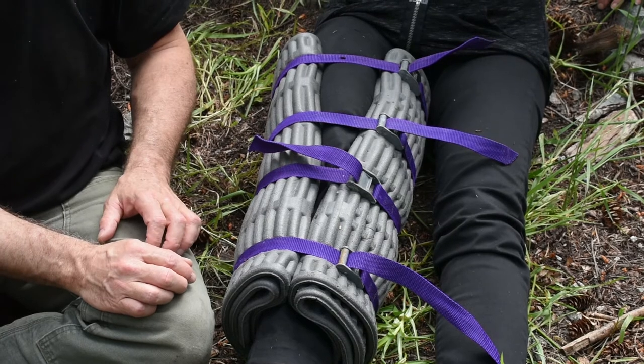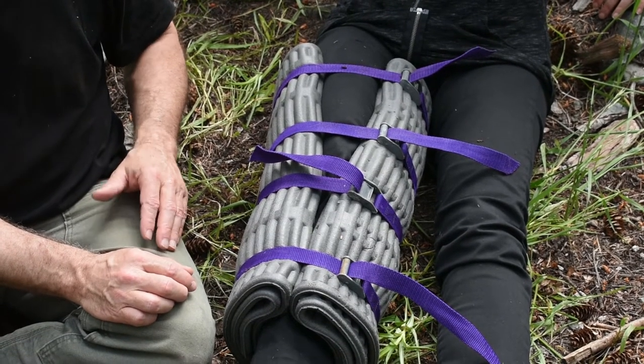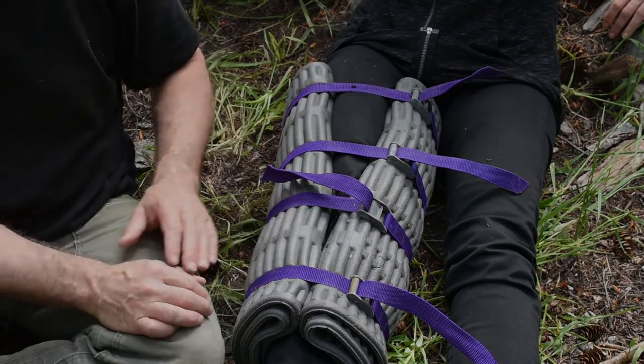And there you have it — two splints using the sleeping pad and some ties to make a really solid knee splint or ankle splint.